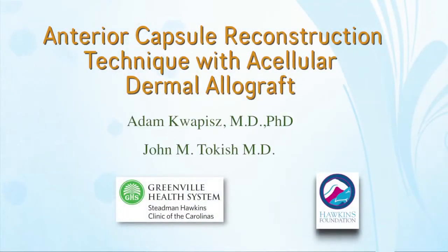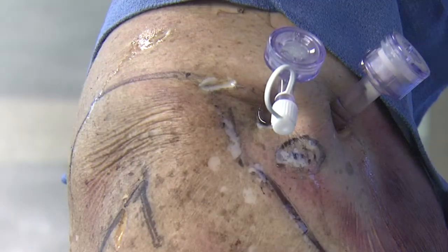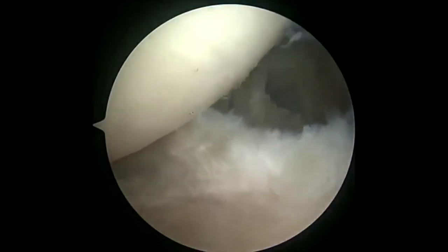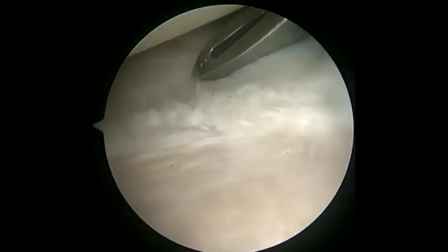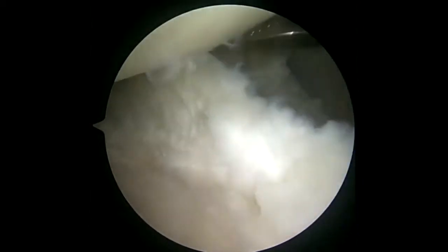This is a surgical technique of anterior capsule reconstruction with Acellular Dermal Allograft. The patient is placed in lateral decubitus position. Posterior, anterior superior and modified mid-glenoid portals are established. A standard diagnostic arthroscopy is then performed within the glenohumeral joint, and each pathology is appropriately addressed.